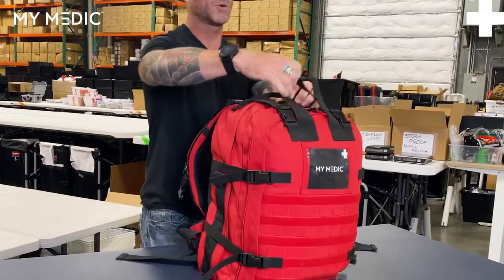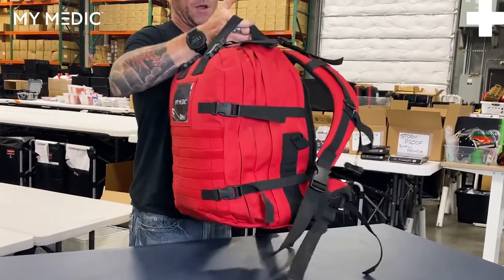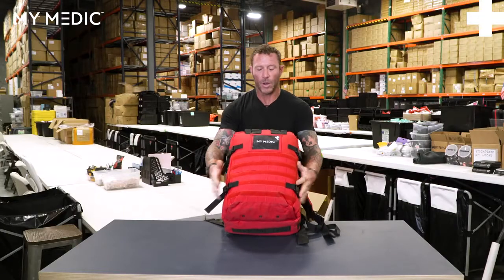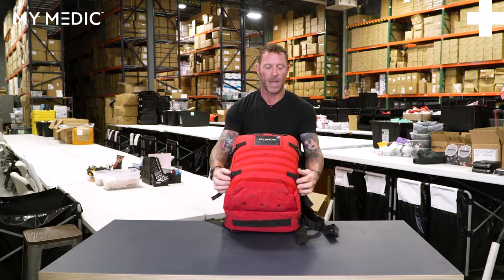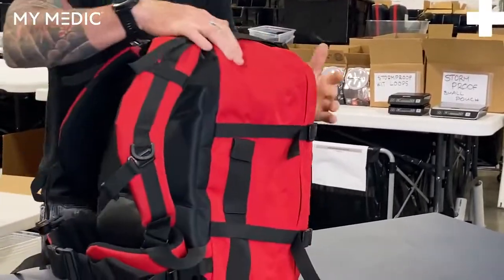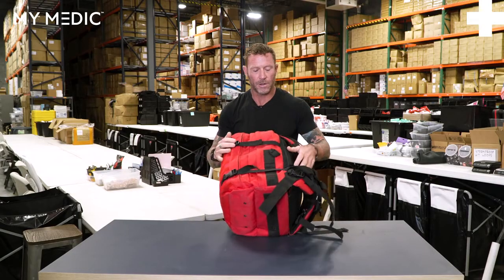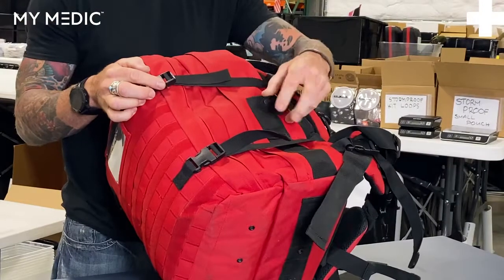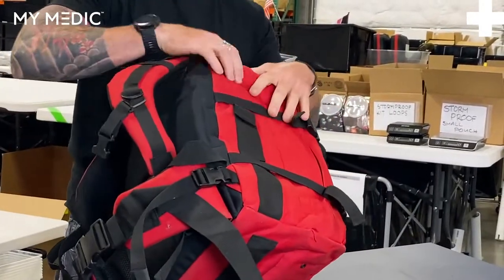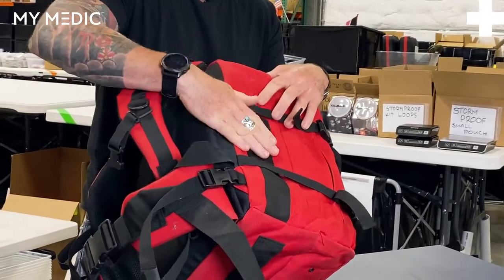You do have a double grab handle up front — you have the single and then the double, so that's easy to carry. Grab those two together and off you go. You've got buckles all the way around to keep things nice and tight — you can see the buckle system on all the sides and the top so you can snug these down. On this side, you'll notice you do have a trauma shear keeper where the handle will snap in. The opposite side has a small pouch with Velcro — a little multi-tool or whatever you want to put in there.